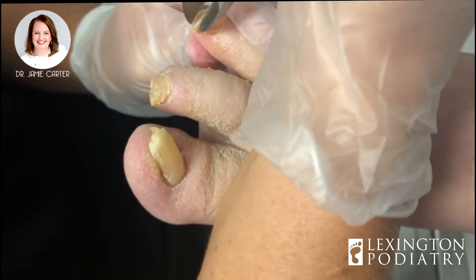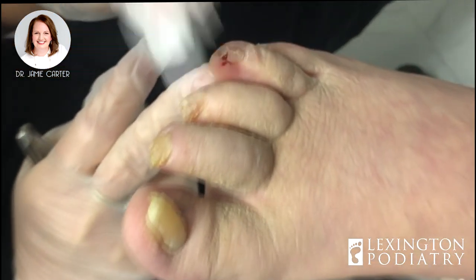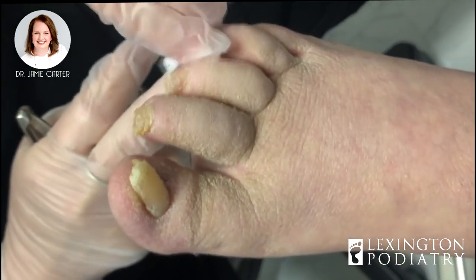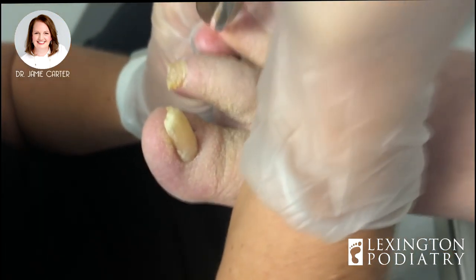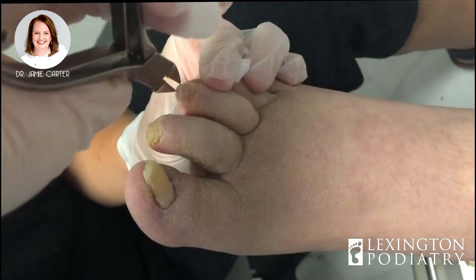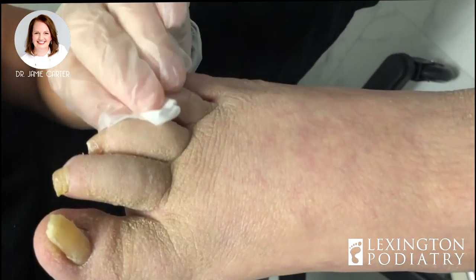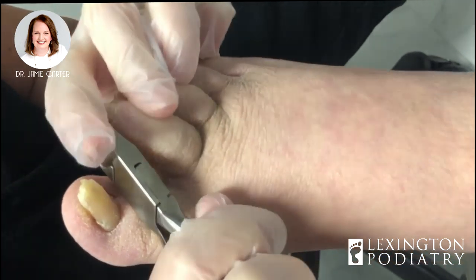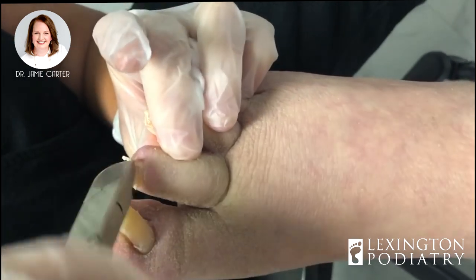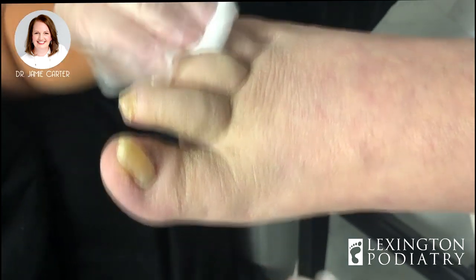I'm surprised he didn't make this toe bleed. Look — it was digging in so bad it actually bled a little when I pulled that ingrown out. Recognizing it is one of the biggest issues. A lot of times diabetics don't have feeling in their feet, so they don't know when they cut themselves. Did you feel it when you cut it? — I just saw it bleed. If you don't have good circulation it may not bleed right away, and you might not know it for a day or two weeks.